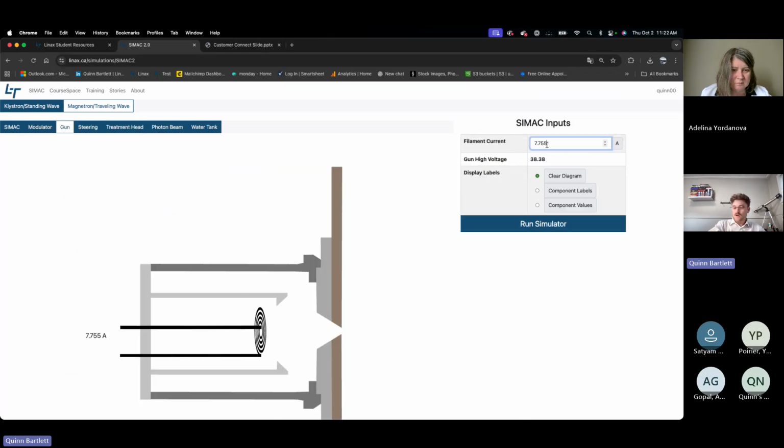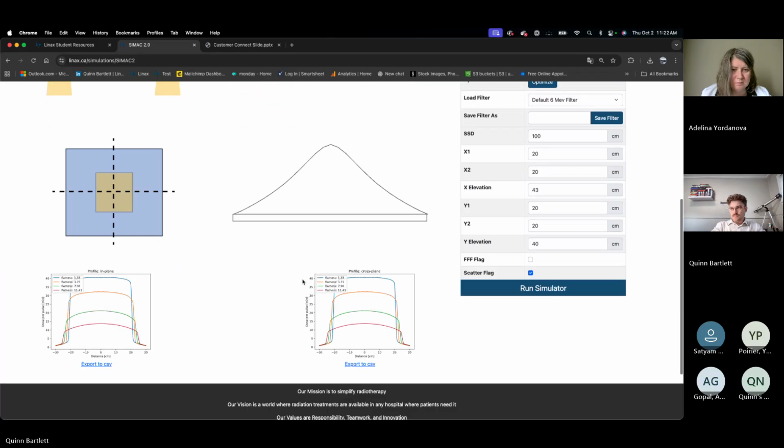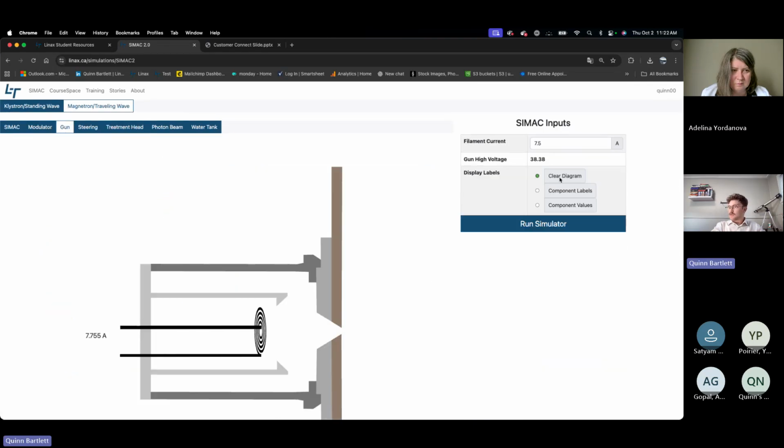Because then if we were to run this down, it's really not liking that. That's disappointing. Sorry, guys.